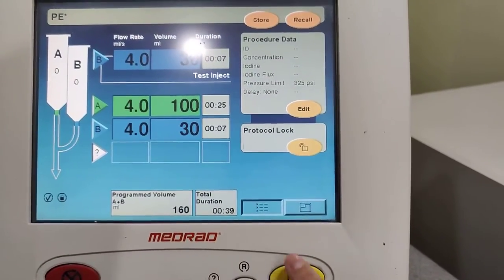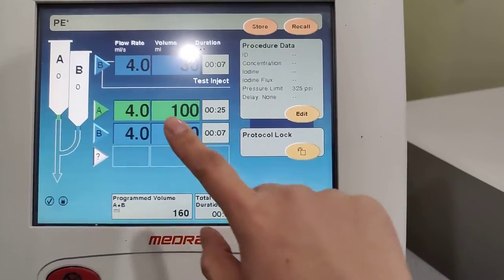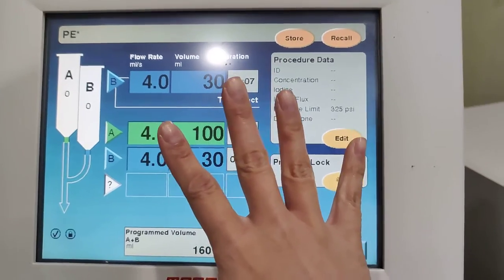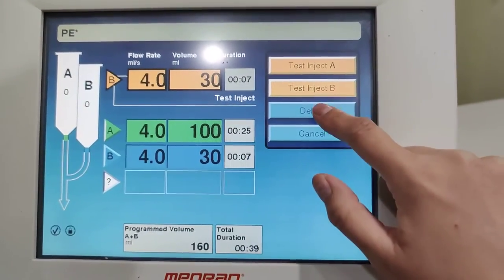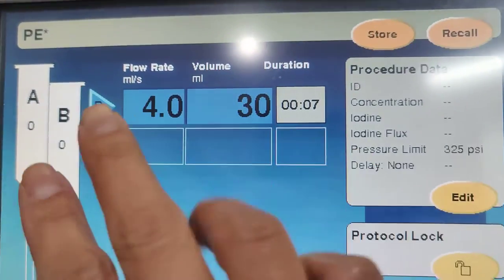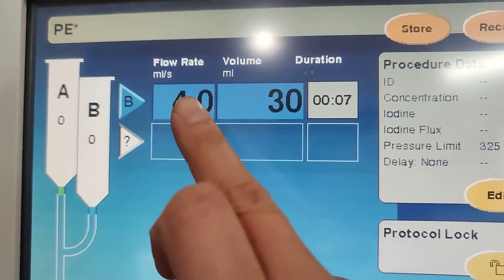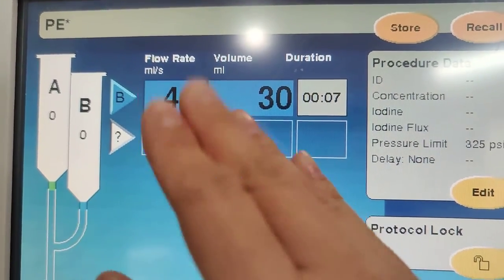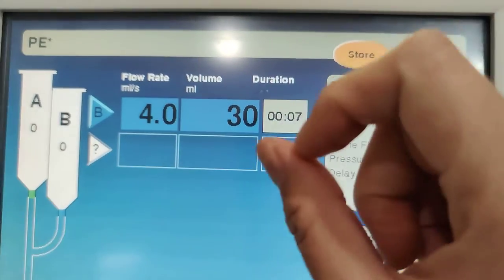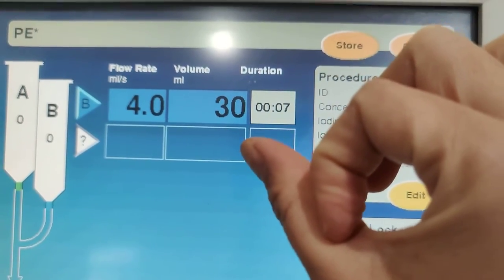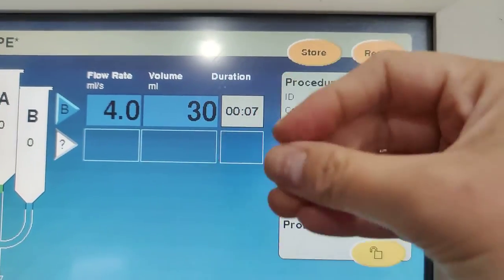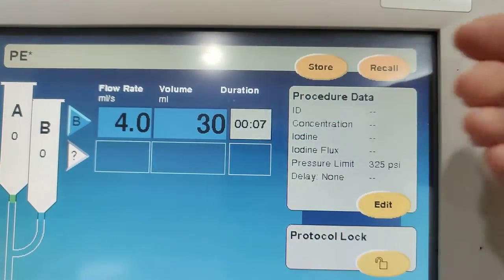To stop the injection, pause the contrast first — it will highlight how much you gave. Press X and it brings you back to the protocol screen. Delete the remaining entries and then flush the remaining saline through to wash the contrast out of the IV line, confirming there's no contrast left in the IV.